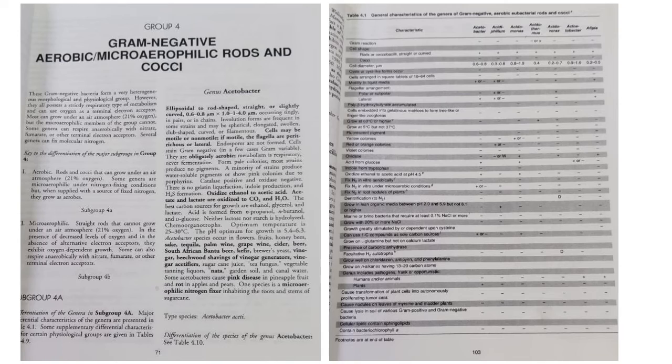Now I will open Bergey's manual. I will go to the groups and see what groups match my report. The fourth group is what I could match my results with. So I will open this fourth group and see what all genera are described here, and I will move further for biochemicals.